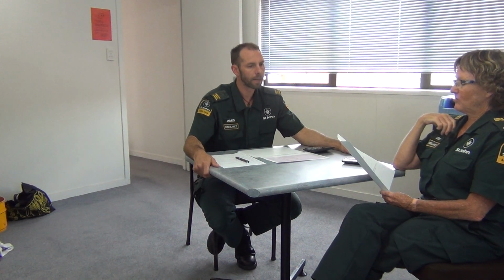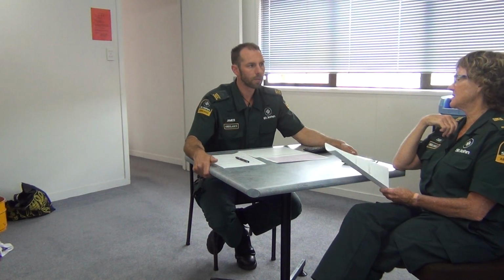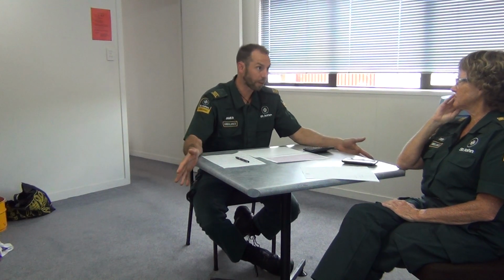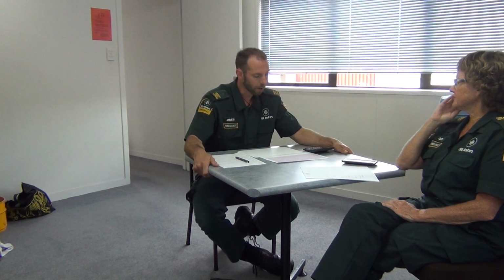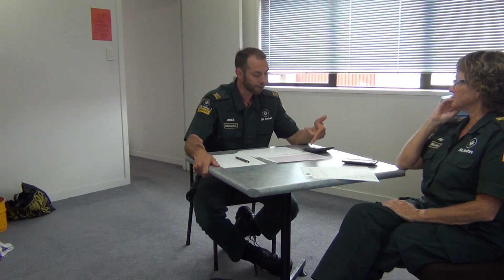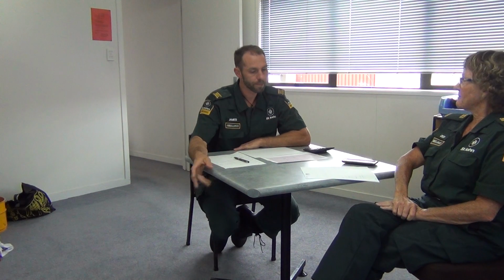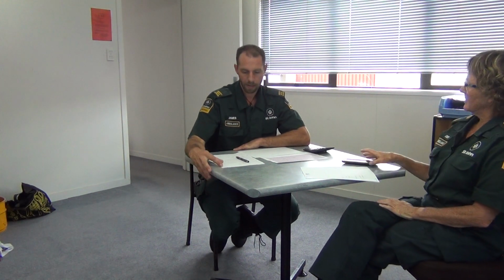What are reciprocal changes and what do they show? Firstly, reciprocal changes demonstrate that it's a STEMI presentation, and I'll use this as an example. The inferior leads are looking at the bottom of the heart, and the high lateral leads are looking from up here. So it's actually an opposite view. They both look at the opposite. So one's elevation and one's depression. So you have that opposite view going on. Okay. So that's that one.